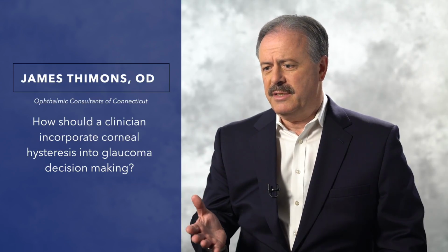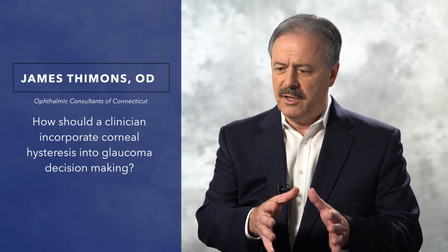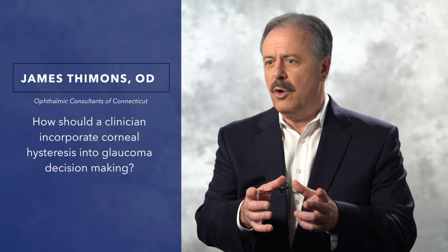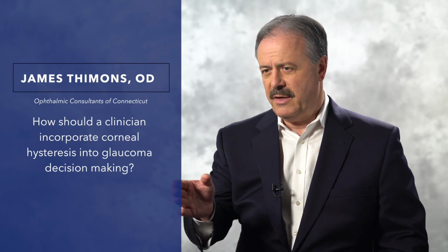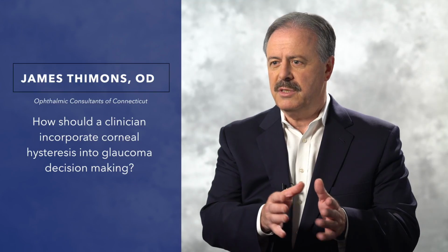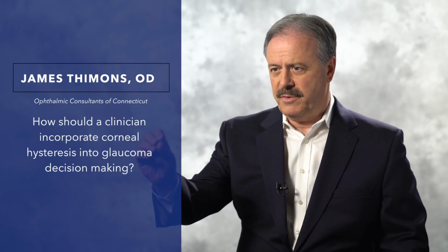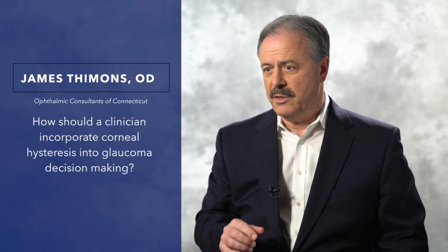I would analogize it as the A1C hemoglobin of glaucoma, because in diagnostic settings in diabetes, we use A1C to see the global effect of diabetes on the system, and doctors use that as a predictive value. That's how I tell my patients that we're going to use this information. This is just like your testing in diabetes to tell me how well you're performing and what your risk is going forward, as well as your current risk for disease diagnosis.